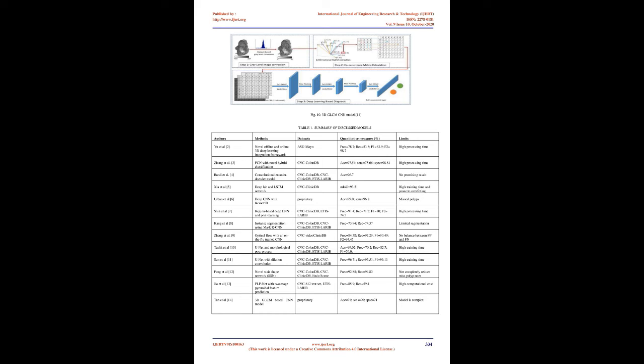Besides, some intestinal folds in colonoscopy images are likely to be mistaken for polyps. To address these issues, a specific dual attention module is applied to refine the output feature of each residual block in the backbone. Then a multi-scale fusion module, MFM, is designed for fully fusing features of different layers. Fig. 8 shows an overview of the SSN model.